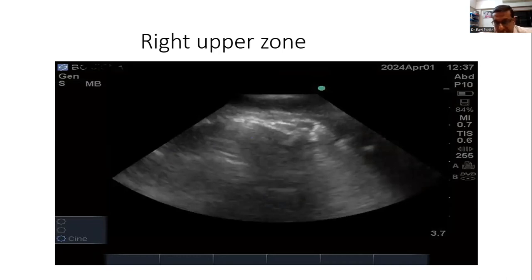So you've lost pleura there and you've got irregularity to it. Putting Doppler there sometimes can be helpful. But the other thing that is really helpful in this particular situation, especially if you want to differentiate atelectasis, is that usually atelectasis is very geometrical. And this is not geometrical at all. This has got a very irregular broken edge to it. So for me, it would favor a fractal sign.